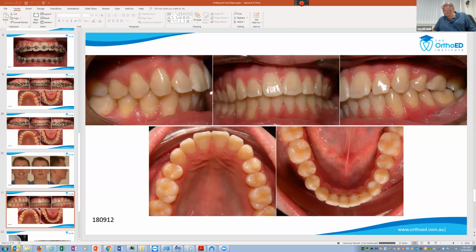So the braided wire is a very soft wire that will just maintain your alignment, maintain your torque, and then with the rubber bands, in the posterior segment, posterior box elastics can overpower that wire to help sock in the occlusion.